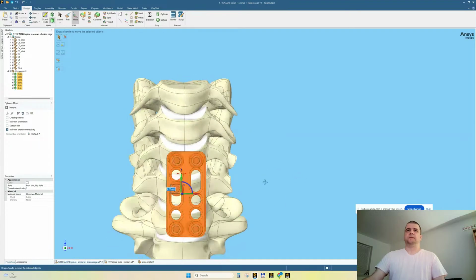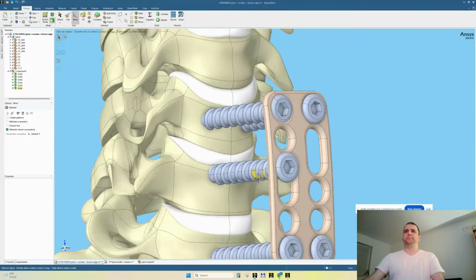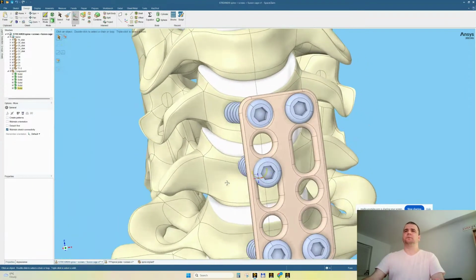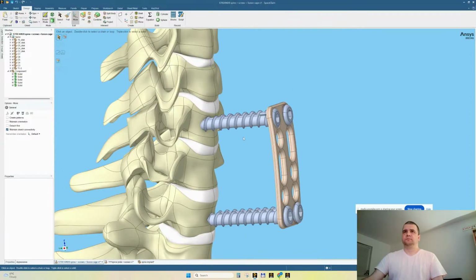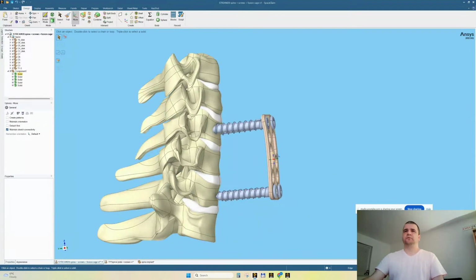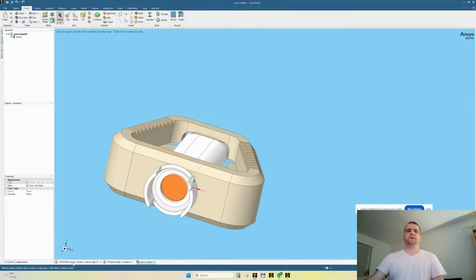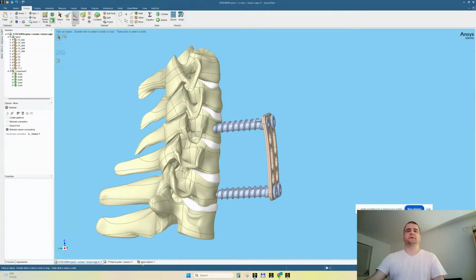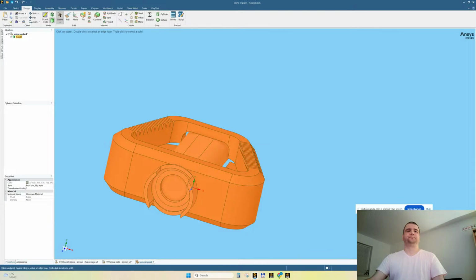So, you know what? This is what we had at our disposal. We're not going to need this screw. Yes, we're going to use only this plate. And in the meantime, we're also coming with this spinal implant. So, copy and paste.